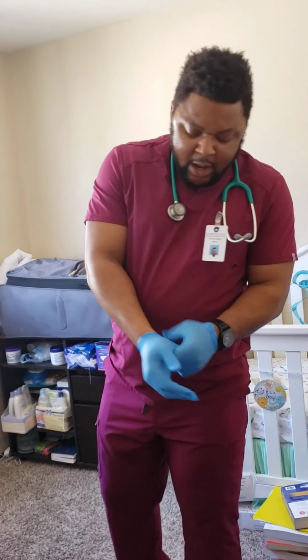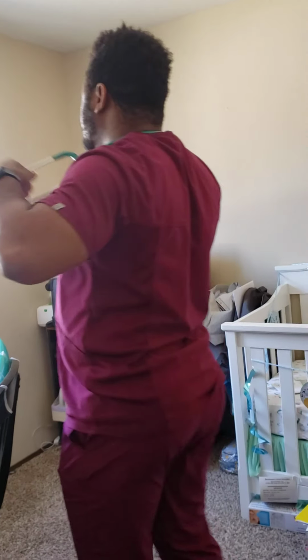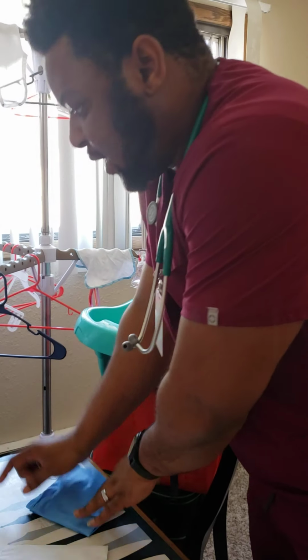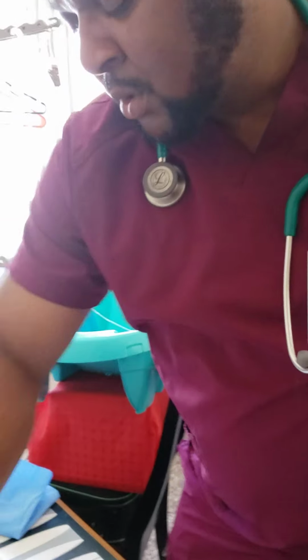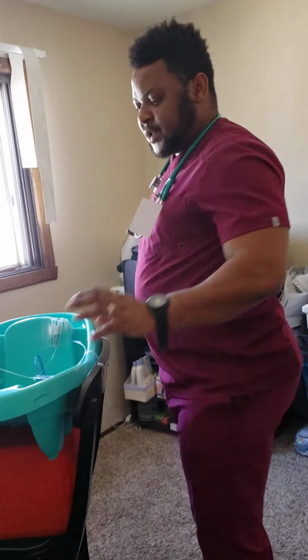So I'll just go ahead and continue with removal of the tube. So for removal of the tube, I want to check on the doctor's order, making sure it's the right patient, check on what I need to do, and after doing that, I get my appliances. For my appliances, I'll be using a drip sheet, which is right here. I'll be using my syringe, which is right there, to draw my water. Then I'll be using my paper towel. So those are the three appliances I'll bring in.